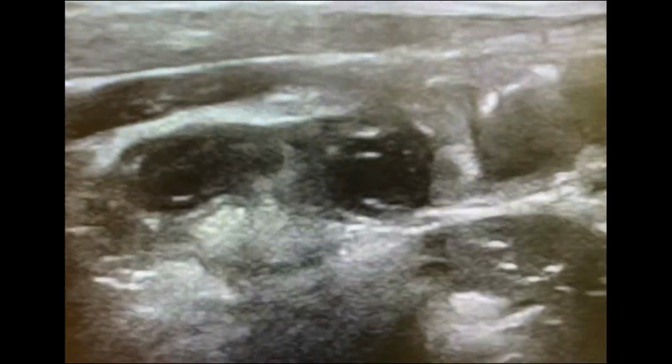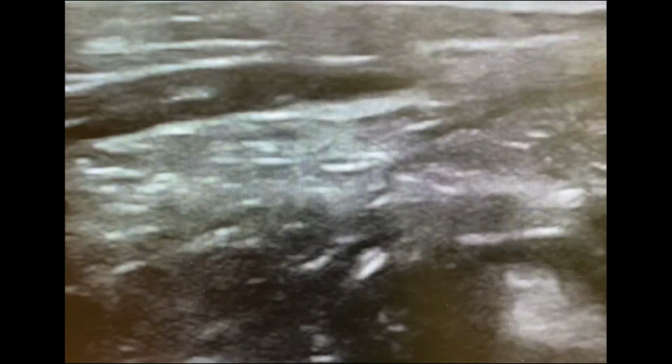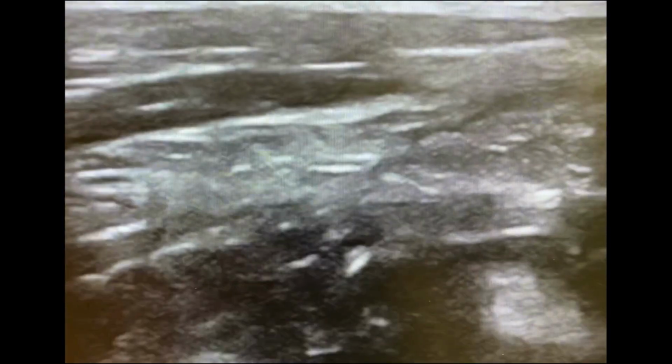These images are of slightly lower resolution because they were forwarded to me via text. These images were obtained in the right lower quadrant right over the area of maximal tenderness. Like the previous image, we see a tubular structure visualized in a hybrid of short and long axis, which can be common when scanning a nonlinear structure. The dilated tubular non-compressive structure is concerning for acute appendicitis.